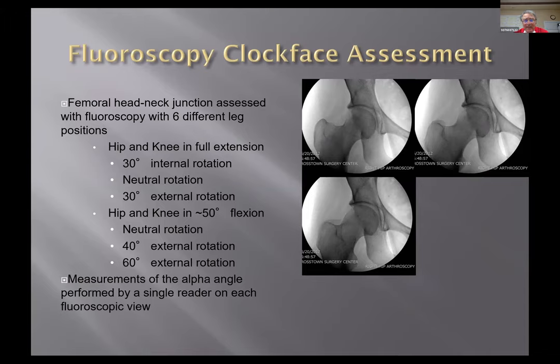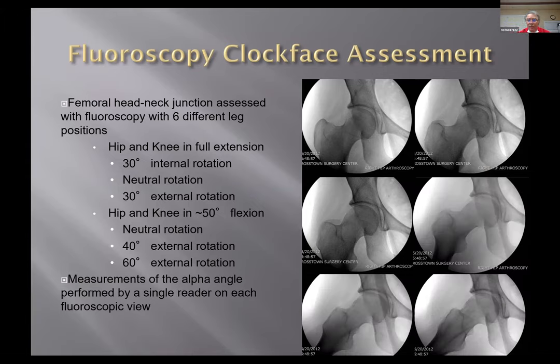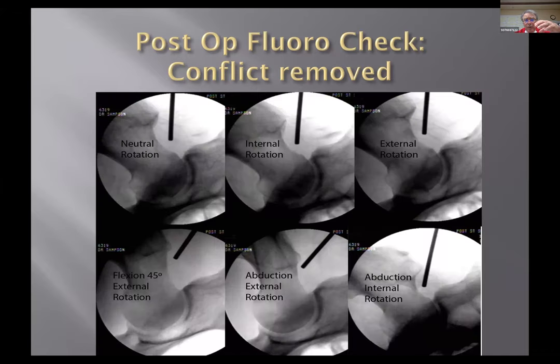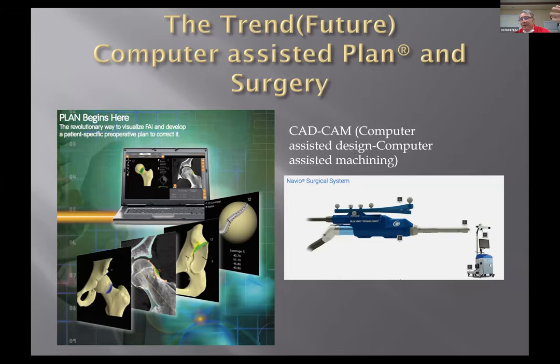We look at it as a clock face analysis. We're trying to see our pre-op films and our CAM impingement. We're trying to look at these different views. Chris Larson's really good about showing the ways you can fluoroscopically assess your hip in the OR. So different amounts of flexion, extension, internal external rotation, whatever you do to see that area posteriorly on the hip. And then can you see that your conflict has been removed? So if you have to turn the hip to get that false profile view, you've got fluoro there, you've got your camera there. Between those, that should help you.